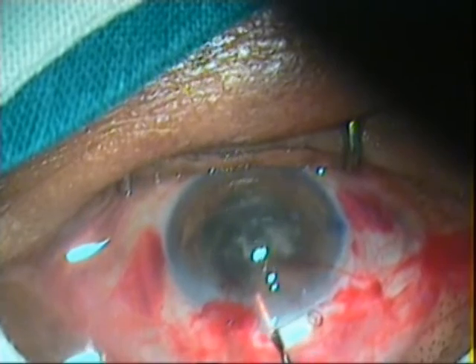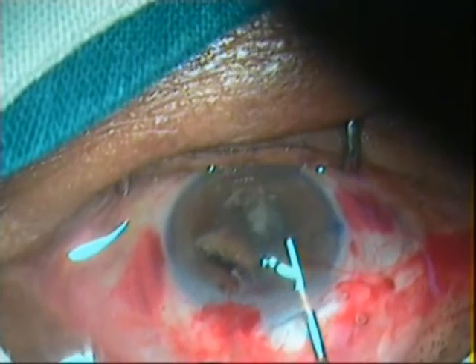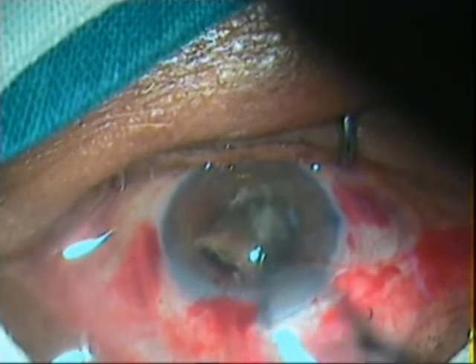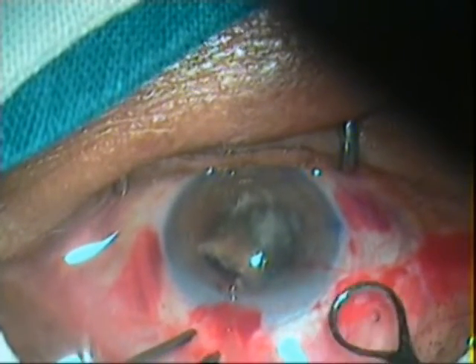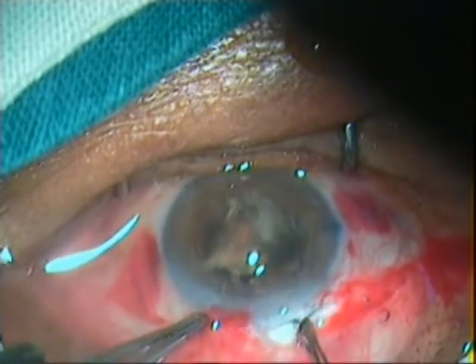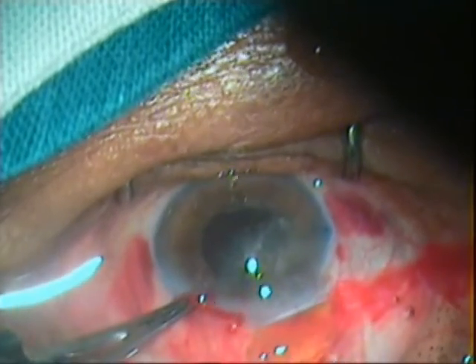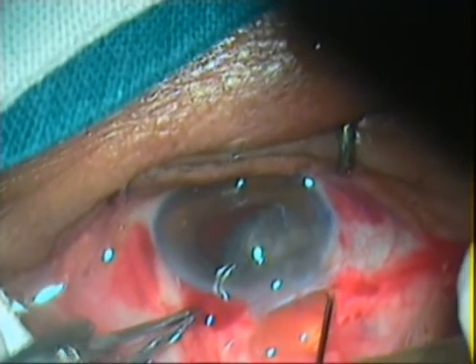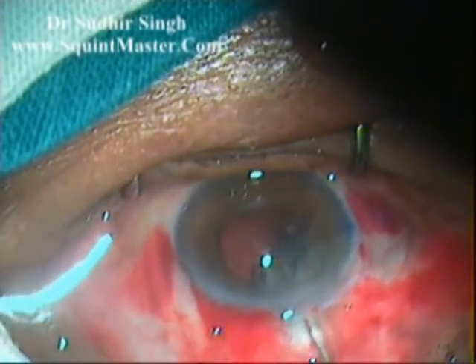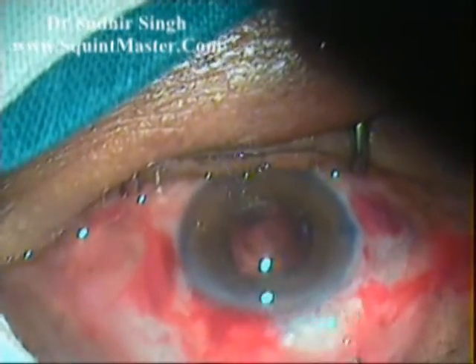Using viscoelastic, the engaged part of the nucleus is pushed back into the anterior chamber and rotated so its longitudinal axis coincides with the longitudinal axis of the tunnel. Again, viscoelastic is placed between the cornea and the superior surface of the nucleus and between the nucleus and iris. The lens loop is introduced through the tunnel and positioned between the iris and the remaining part of the nucleus. The remaining part is engaged in the lens loop and slowly withdrawn from the anterior chamber while the posterior lip of the tunnel remains depressed.